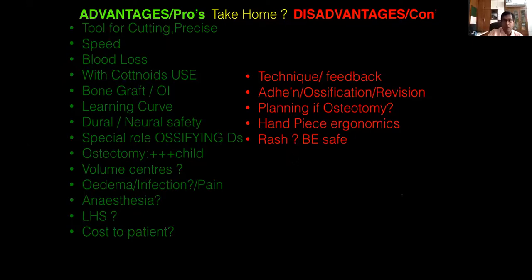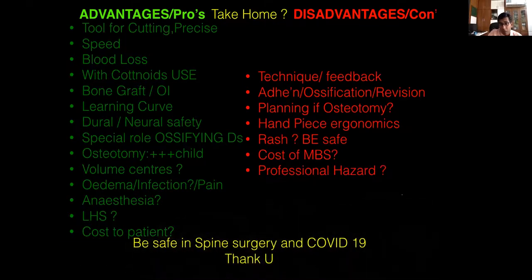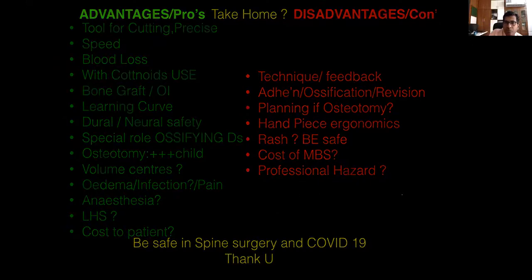Feather touch, Dr. Hegde already mentioned it. The cost of the device doesn't make any big difference when compared with a burr itself, so it doesn't cause much of a cost rise. Yes, professional hazard, we may be sitting on one, but be safe. In spine surgery, it does make a very big difference, and it is safe. Thank you.